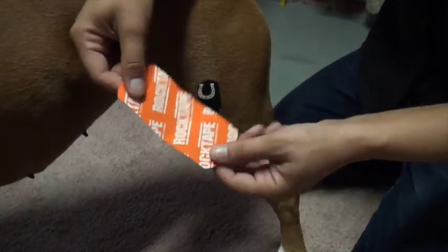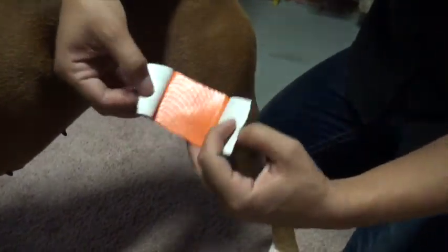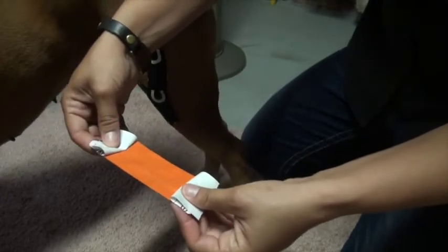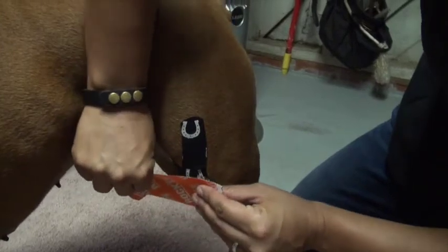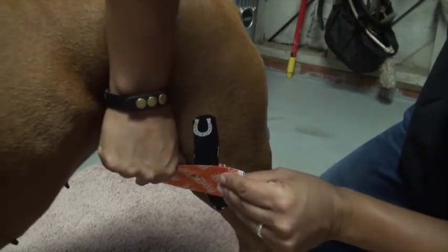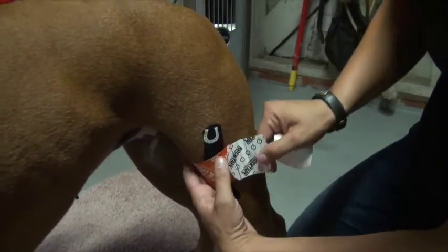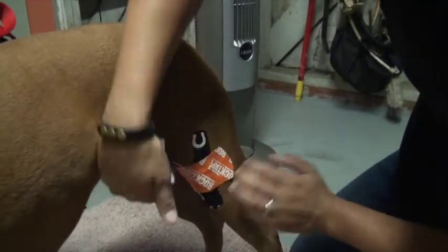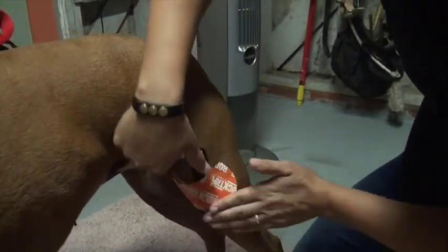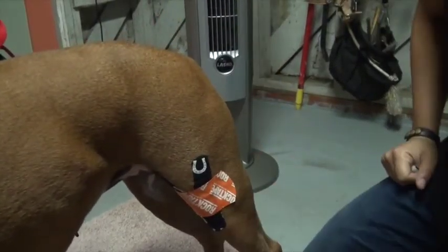So we get the I strip cut. I'm going to rip it in the middle, pull the paper back a bit. We're going to do about 50% stretch in there because we want to stabilize the joint. So we're going to go right over the area where the patella would be at 50% stretch and just apply that right there to try to give her a little bit more support in that joint area. We're just going to rub it down to try to activate the glue a little bit better. And that is what the knee support would look like.